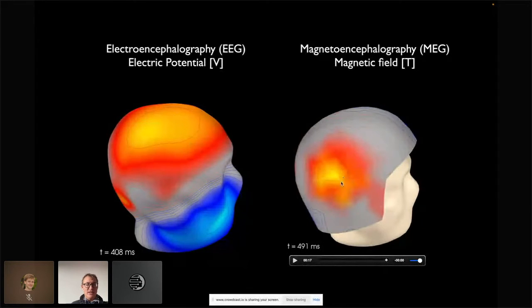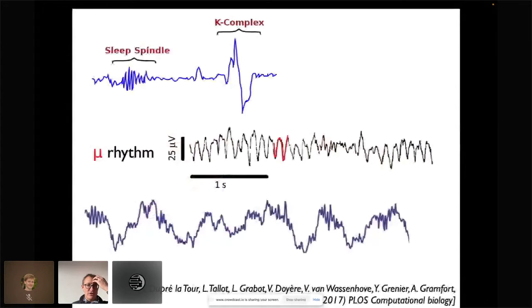So the key property of electrophysiology is related to the time dimension. As opposed to fMRI, which is mostly a spatially well-resolved modality, when you speak about electrophysiology, what people remember is the temporal resolution. What you see here is a number of empirical data.